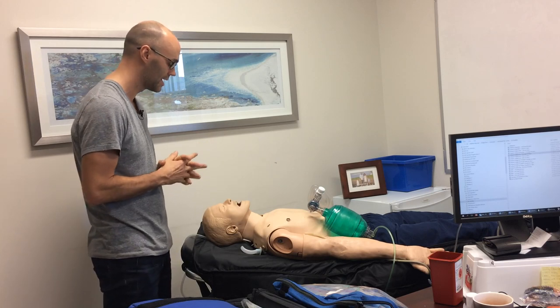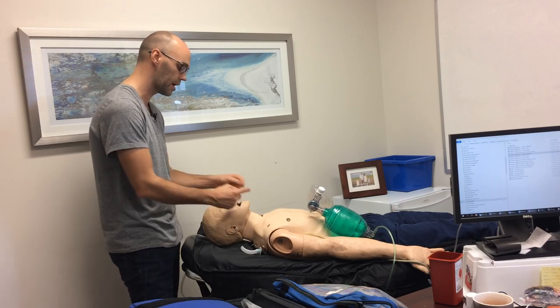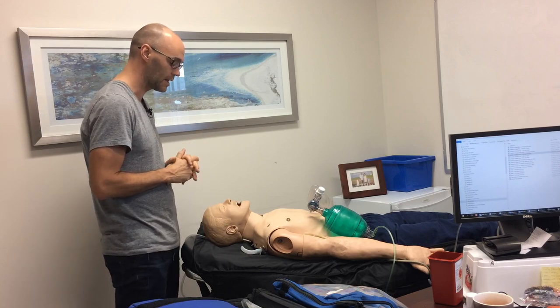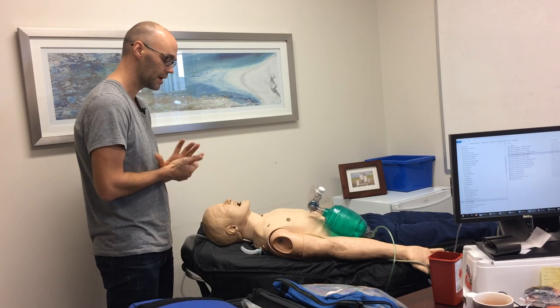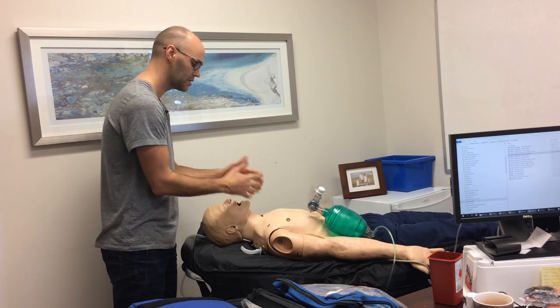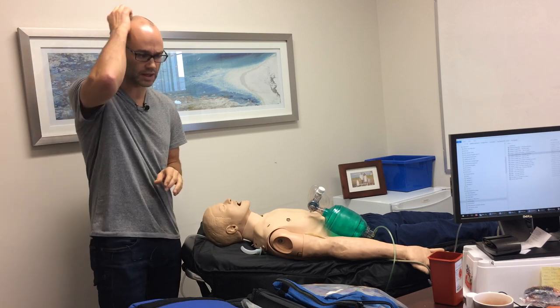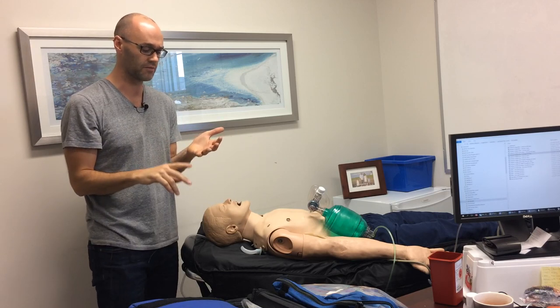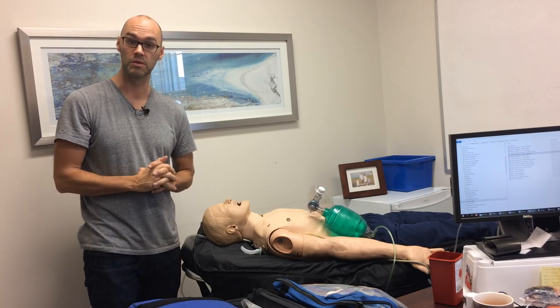Turning our thoughts to extraglottic — we'll think of restricted mouth opening, any upper obstruction in the airway, any obesity, any distortion of the lower airway, or tight lungs. And then DART: any distortion over the surgical airway site, can we put our finger on the anatomy, and do we have history of any tumors or radiation over that area. Given my assessments, I feel like I can intubate this patient, and if I fail, I have both a bag valve mask, extraglottic, and surgical airway if required, that I feel confident I'm able to go through.